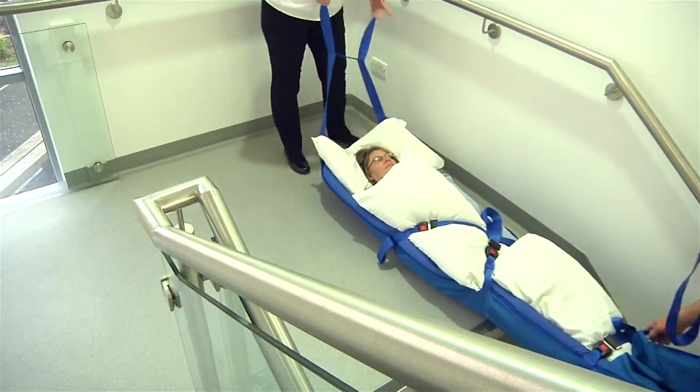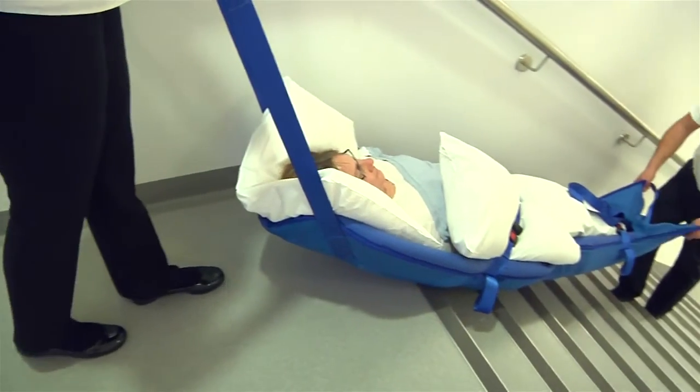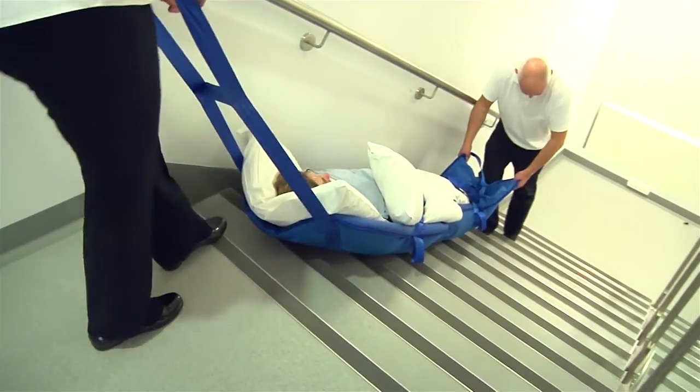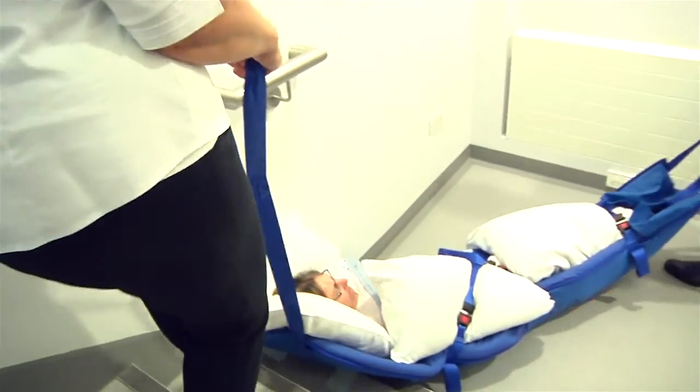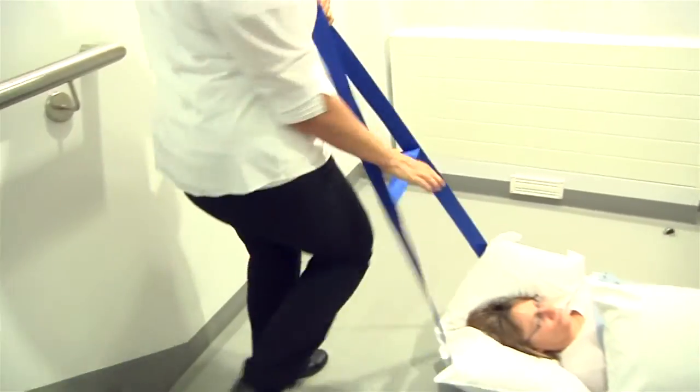If needed, the cross straps can be used to position the ski sled on the half landing area. Good communication is essential to ensure that the head end operator does not overbalance in an attempt to keep pace with the carer at the lower end.